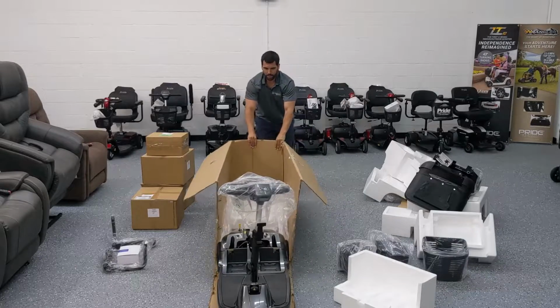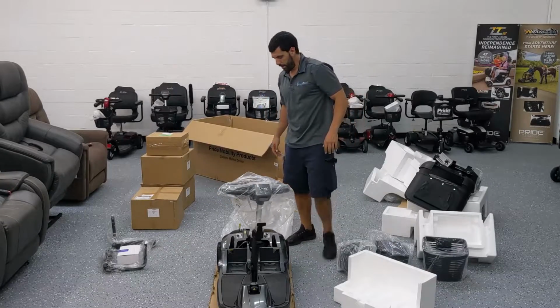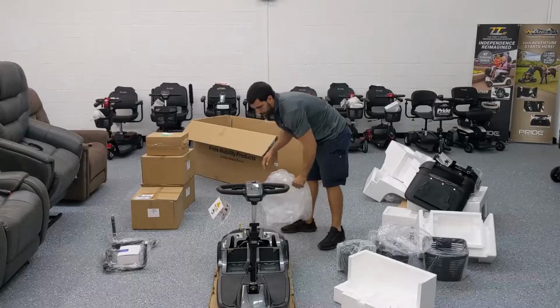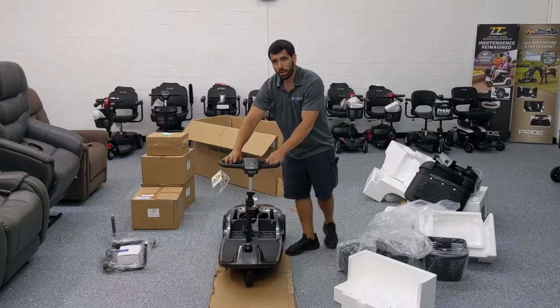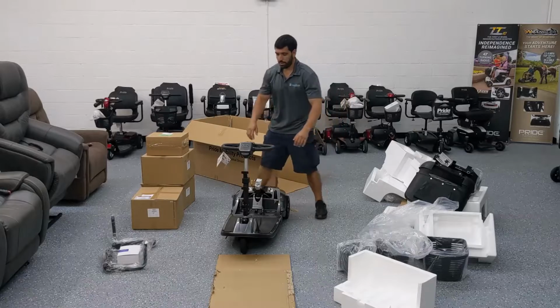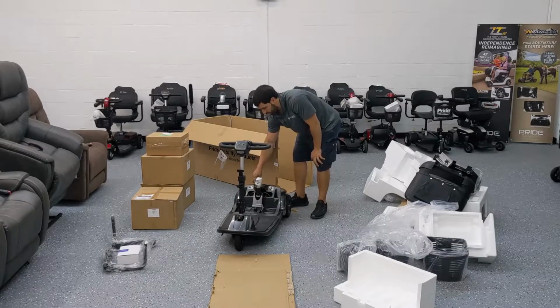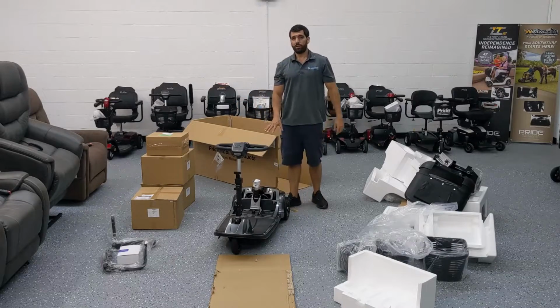So it's on freewheel mode, and it has the ability to be pushed manually. Keep in mind, when it's in freewheel mode, and freewheel mode means it can roll, you're not going to be able to operate the scooter. If you can push your scooter like this, that means your drive lever is not engaged. So we're going to engage it. Now it's locked. It won't move. That's the only way to make your scooter work.